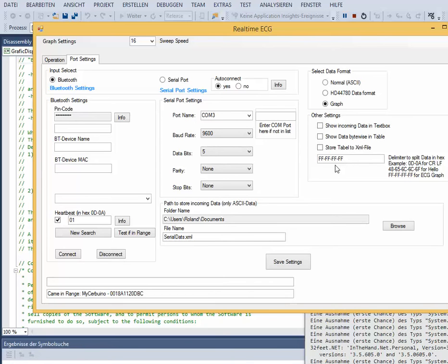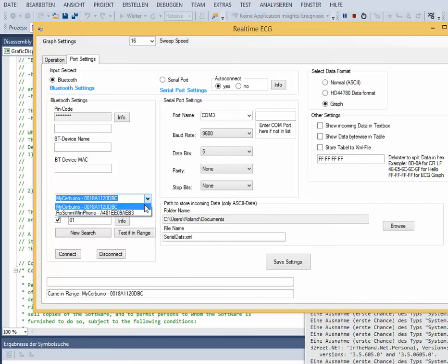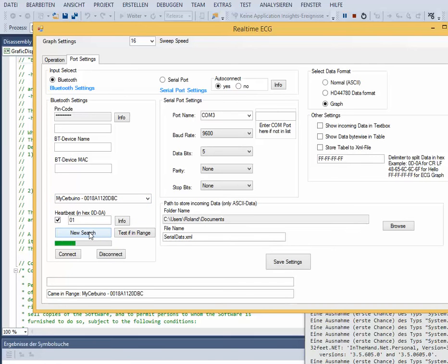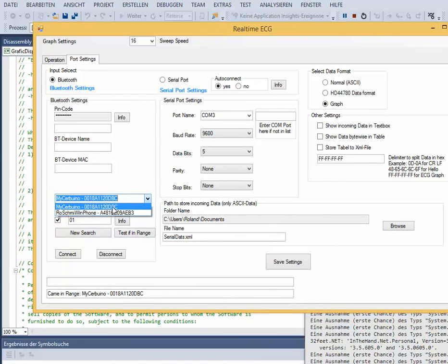Now we search for Bluetooth devices around and select our device.